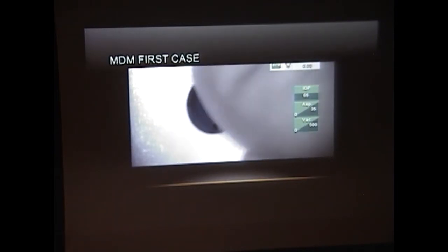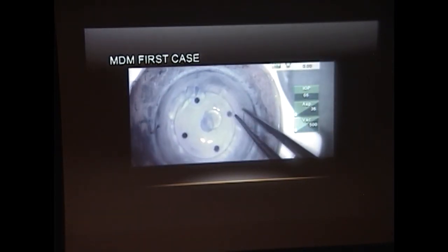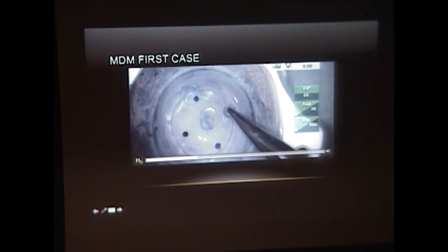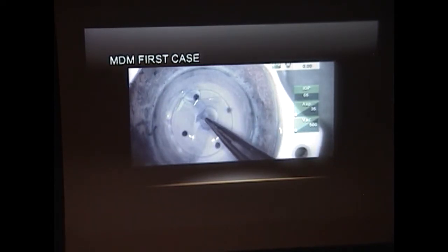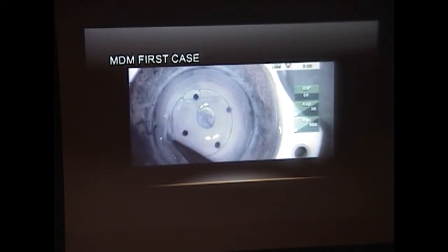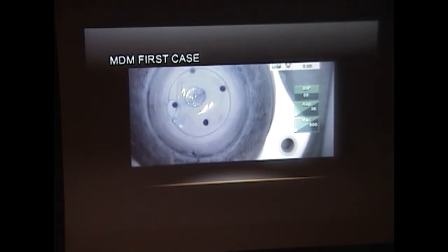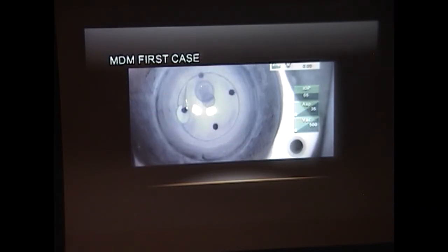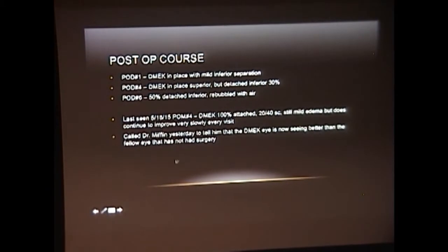And we're lightly trephining. We used a 7.5 millimeter trephine here. And the outer rim, the untrephined rim, is being removed now. What we're left with is just the graft in the center. And that little circle that you'll see is free-floating as we squirt BSS on it.